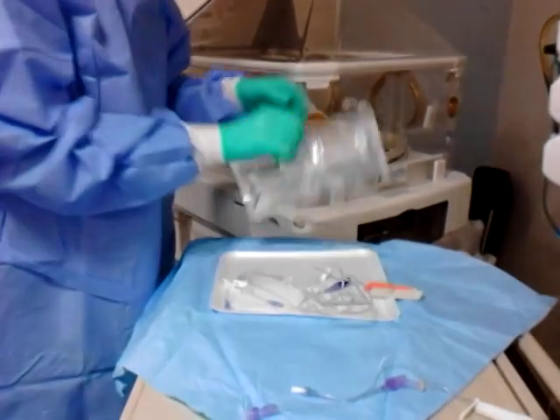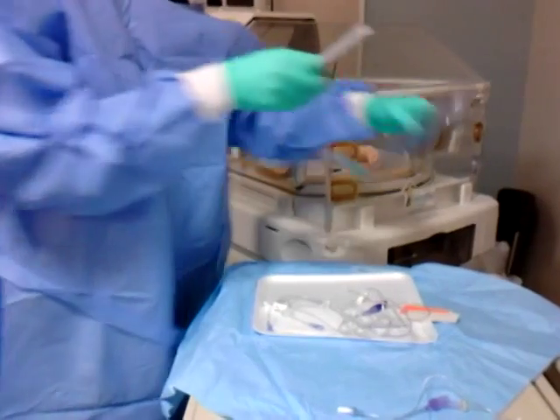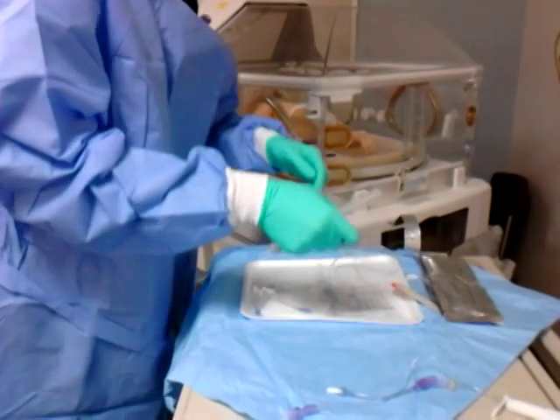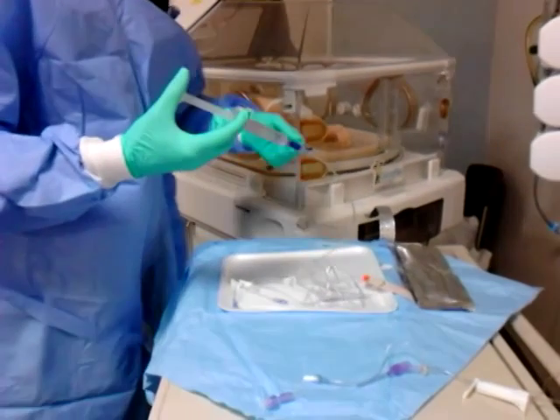Next we're going to open the sterile normal saline flushes. And we're going to prime through on the port that has the clave — the med extension tubing — to the end.